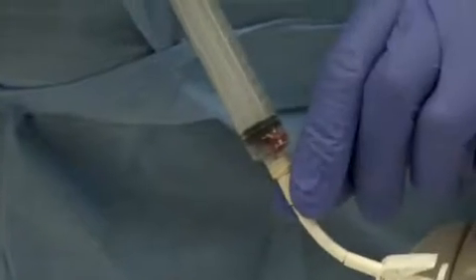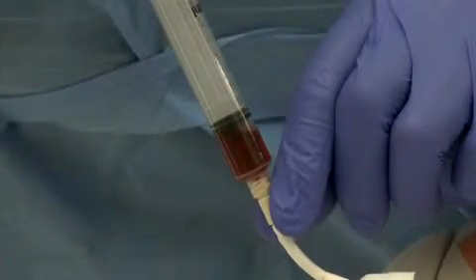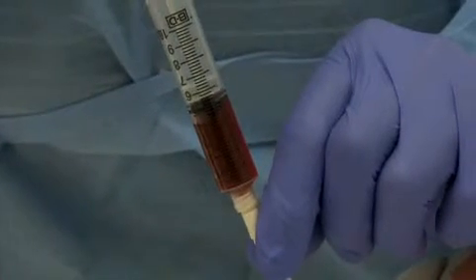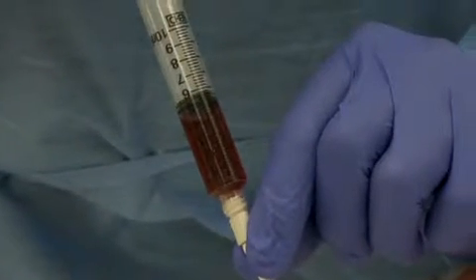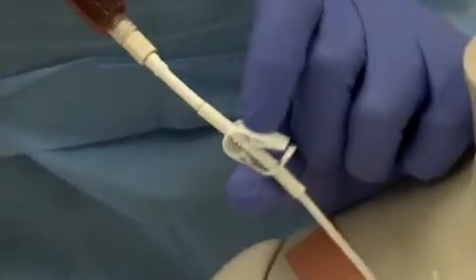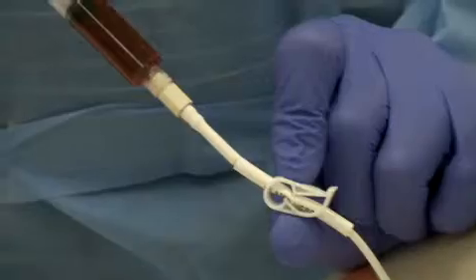This fluid includes heparin that is used to help maintain the patency of the line and blood from the catheter. Close the clamp and detach and discard the syringe.